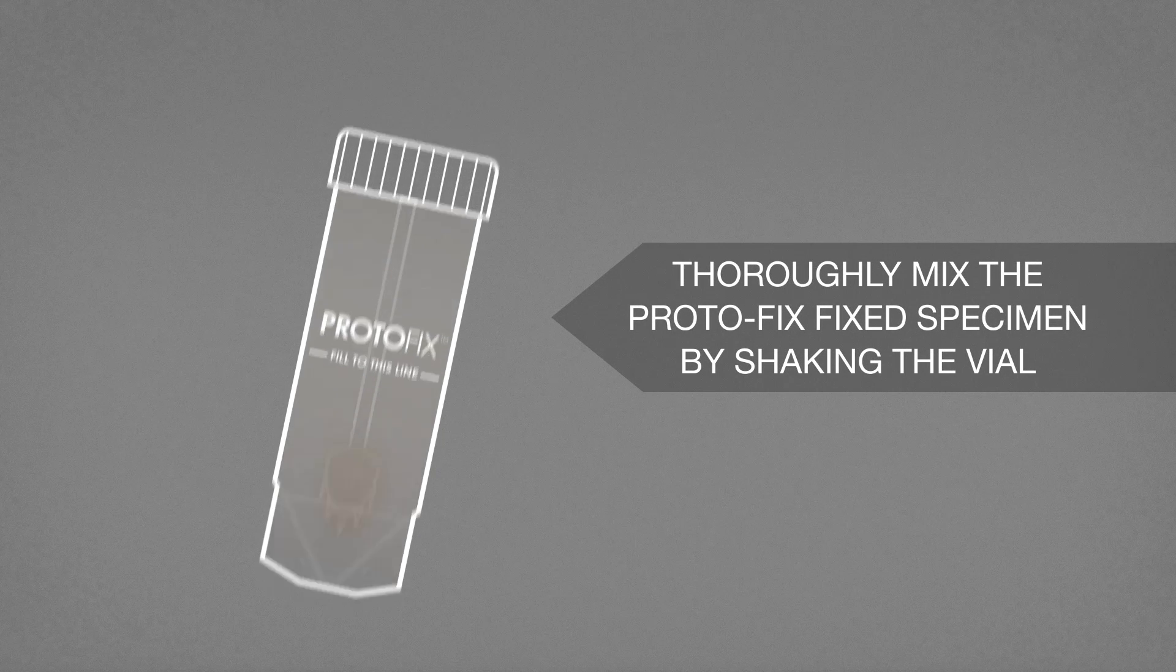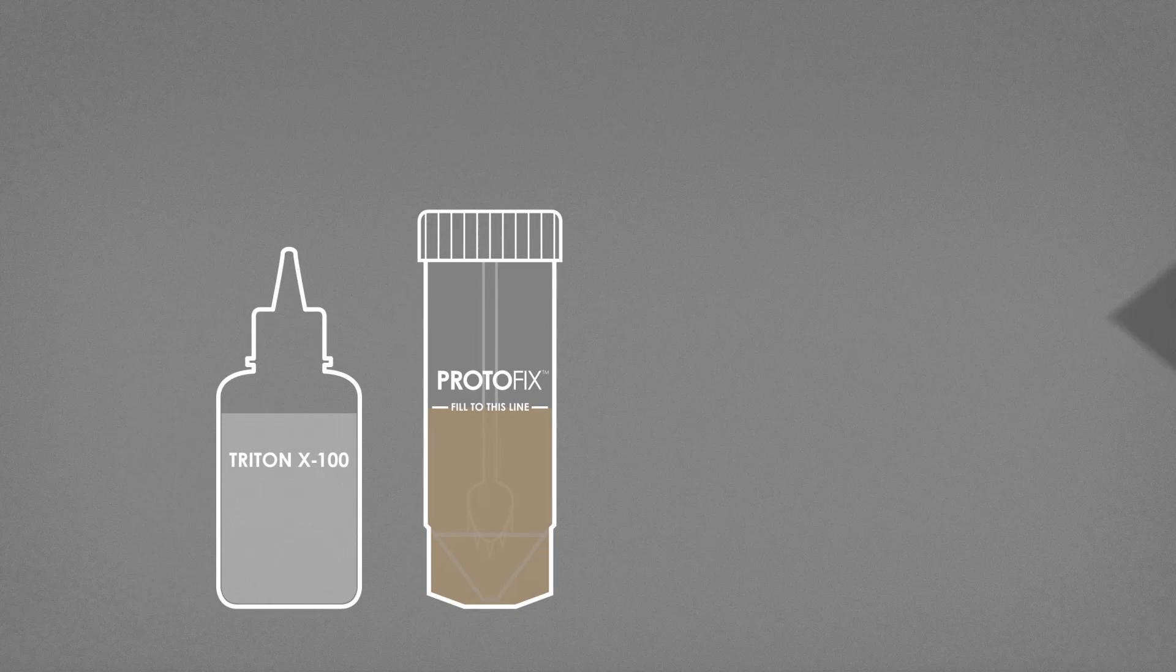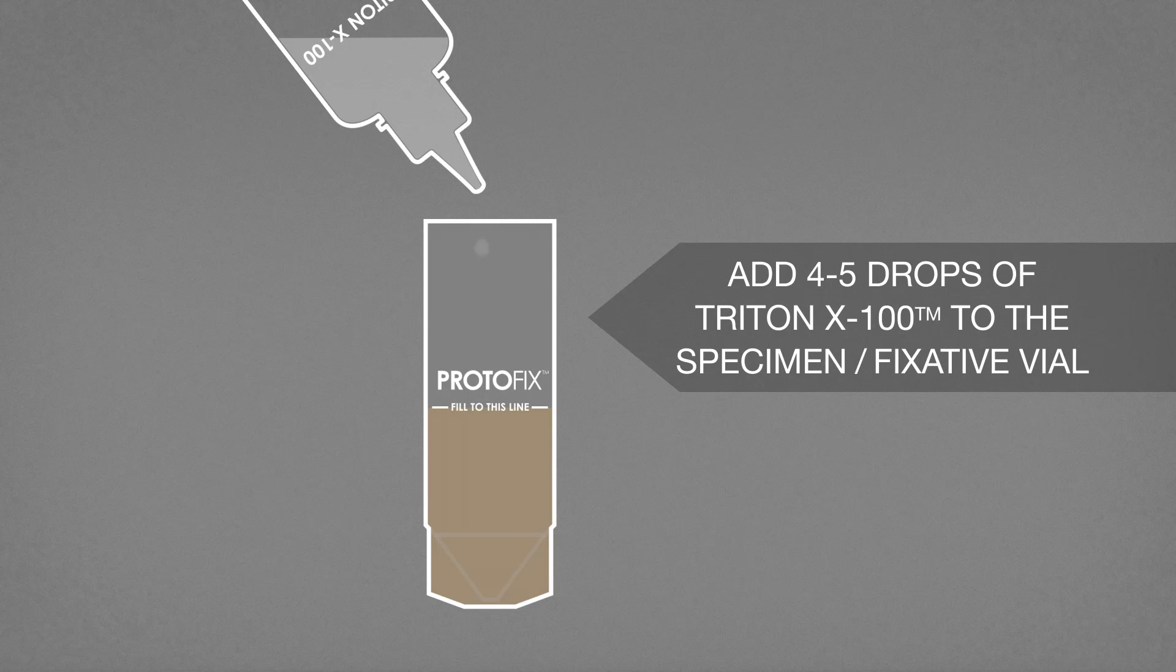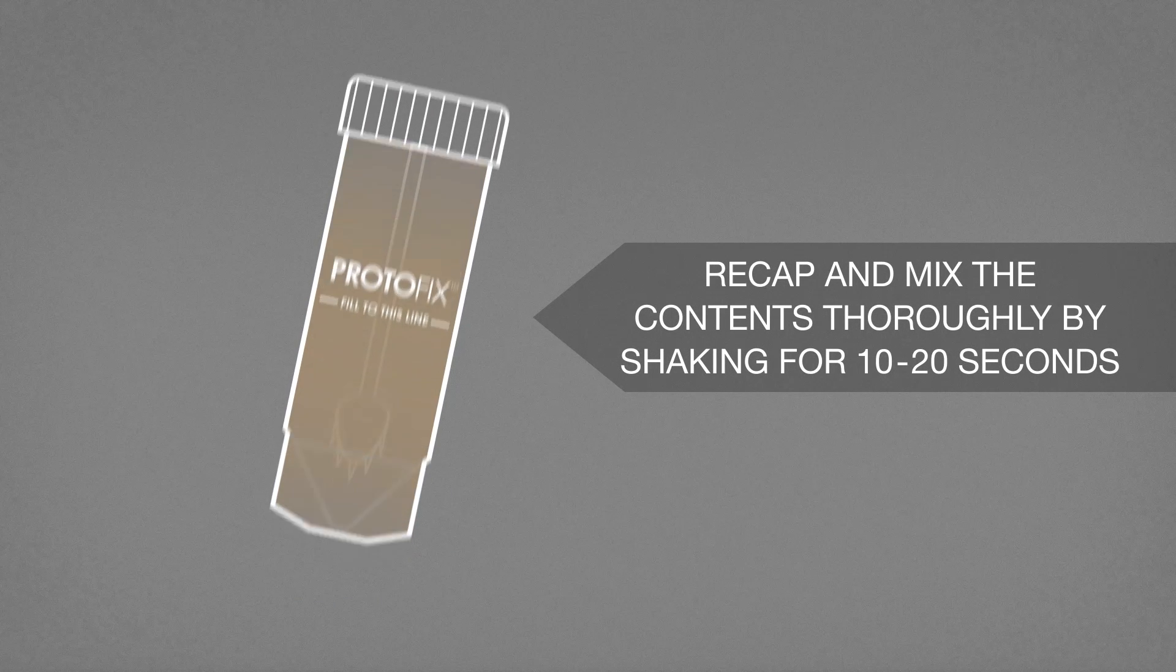Thoroughly mix the Protofix specimen by shaking the specimen fixative vial. Add four to five drops of Triton X100 to the specimen fixative vial. Recap and mix the contents thoroughly by shaking for 10 to 20 seconds.